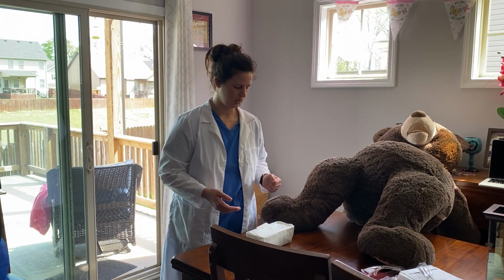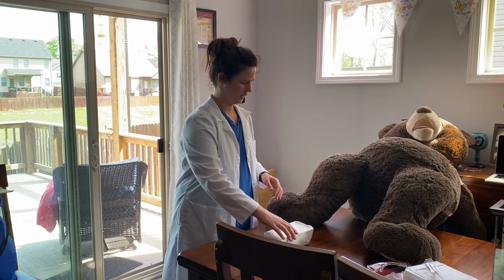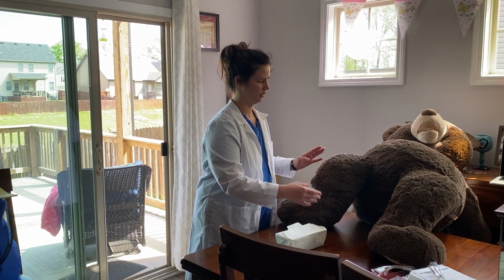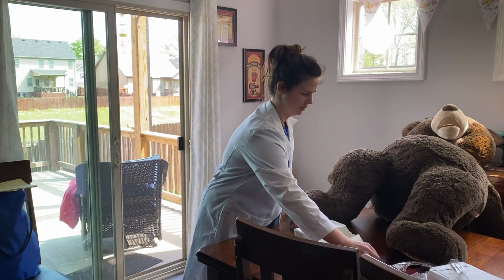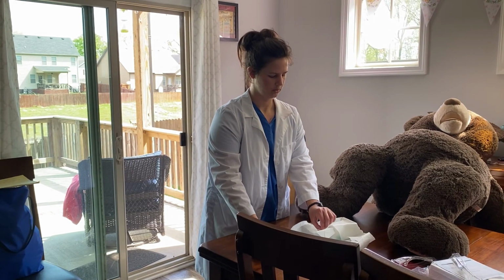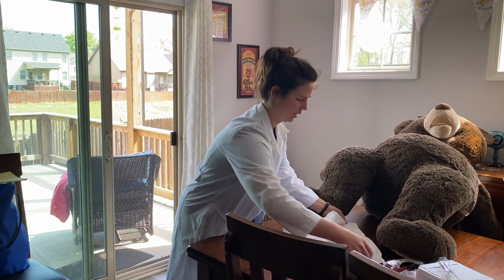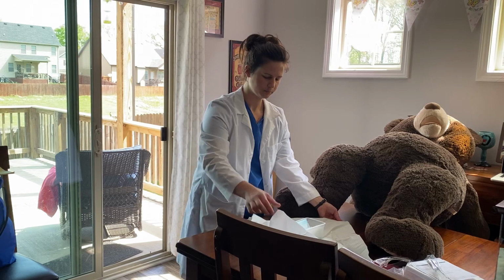So we're going to go ahead and do the in and out catheter on the male. We're going to set up our sterile field in between the legs of the male. We've got him up kind of with the relaxed frog legs here. And like I said earlier, you want to make sure that you check for any allergies, making sure that if they have any iodine allergies, we're not going to be using iodine. You can use hydrogen peroxide instead for the cleaning of the meatus.